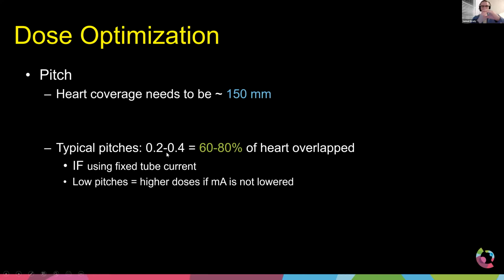So it's sitting there spinning as the heart is beating, and it's able to then sample the heart all the way through its full cycle, systolic to diastolic, one heartbeat. It's able to cover that as it then goes over the whole physical aspect of the heart.